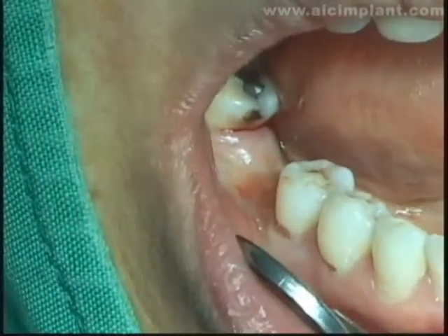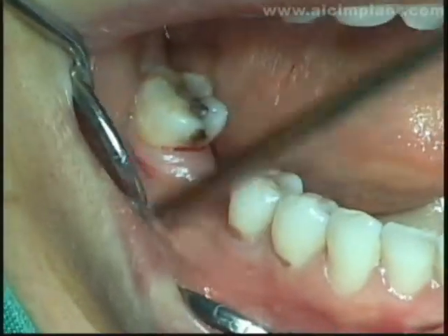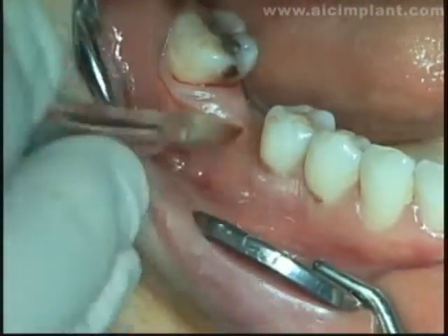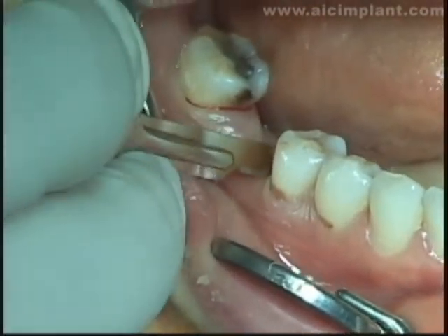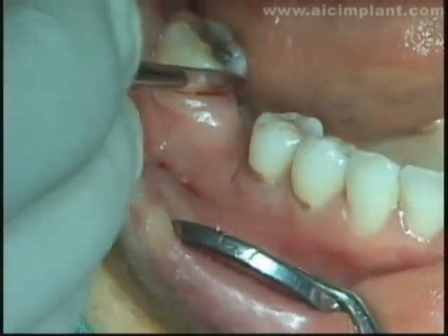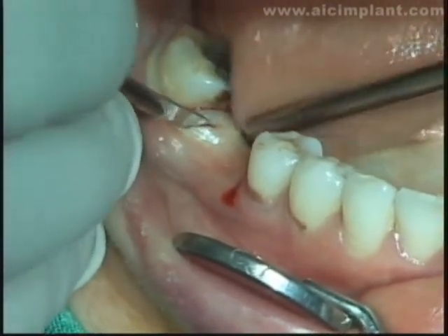I will change the incision design slightly at this time. I will leave the papilla on the left and right and make a small vertical incision. In this case, no grafting will be done, so I will not go over the mucogingival junction. Just proceed slightly further and leave the papilla, and then make a vertical incision. Make a vertical incision here in the same manner.